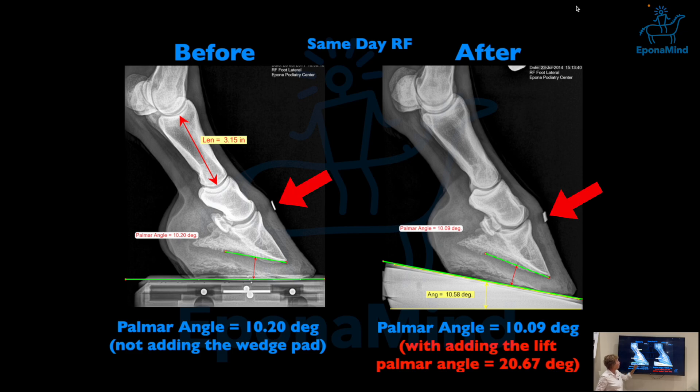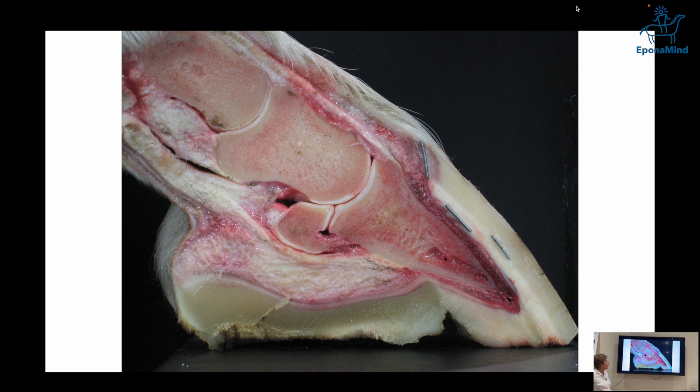This radiopaque marker shows where the coronary band ends, right at the end of that marker, and we'll watch what happens. We have ways to enhance x-rays so we can see the white pigmentation of the wall and coronary band. We did studies on cadaver legs split in half and confirmed the match, so we can see where the white pigmentation of the wall is and glean other things from the x-ray.